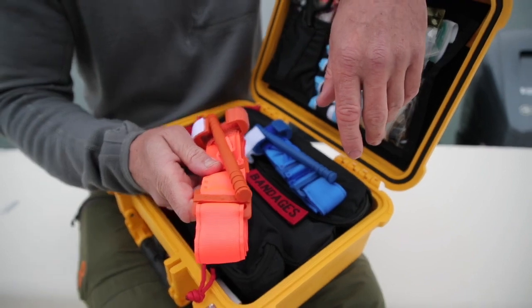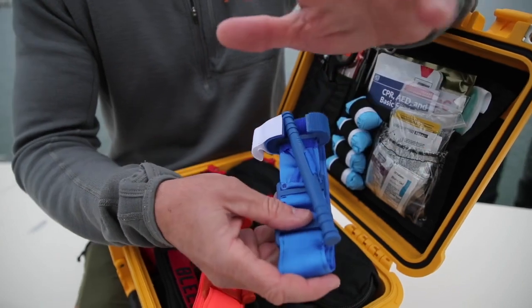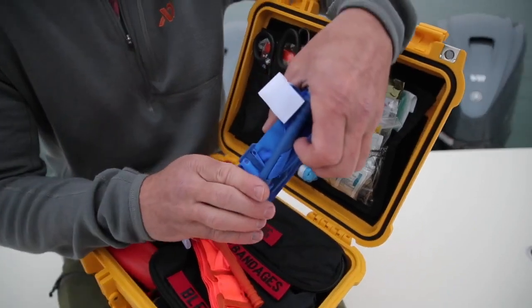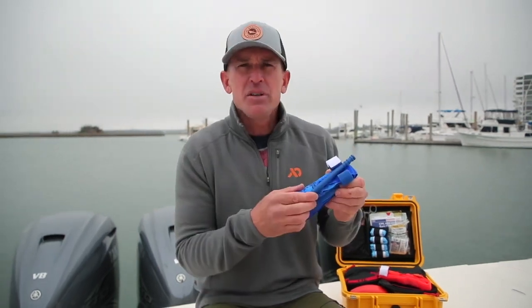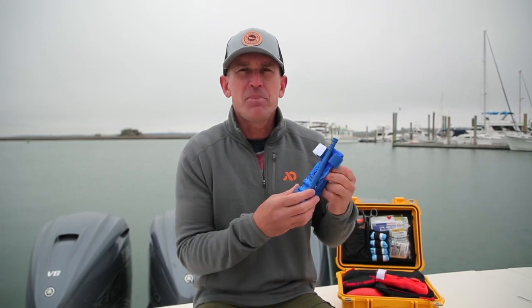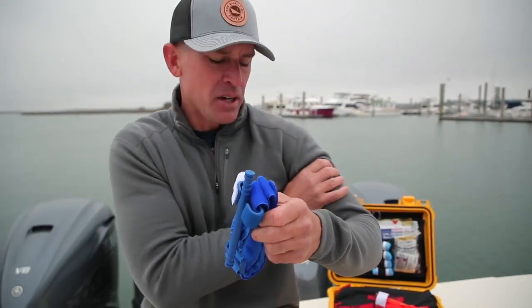Your kit comes with an orange CAT tourniquet. Today for training purposes we're going to utilize a blue one. Always train with a different tourniquet than what you keep in your kit — this is to save your life. Have a separate tourniquet for training. This device is designed to occlude or stop blood flow to an extremity. If you have an injury on a leg or an arm, the idea is to place this two to three inches above that defined wound. If you're not exactly sure the extent of the injury, it is perfectly fine to go as high as you can on that limb.